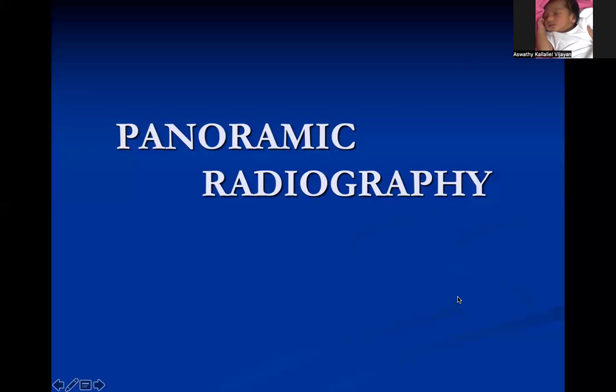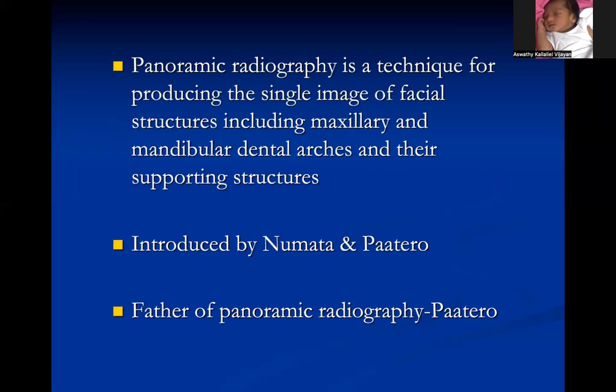So good morning all. Today we shall discuss panoramic radiography. Panoramic radiography is a technique producing a single image of facial structures, including maxillary and mandibular dental arches and their supporting structures. It was introduced by Numata and Paatero, and Paatero is considered the father of panoramic radiography.